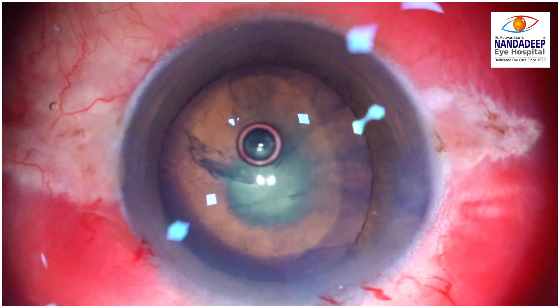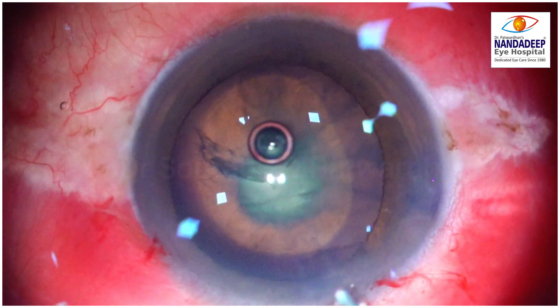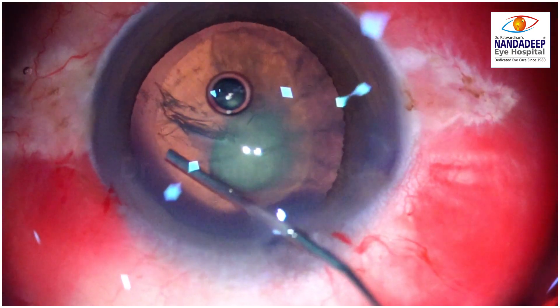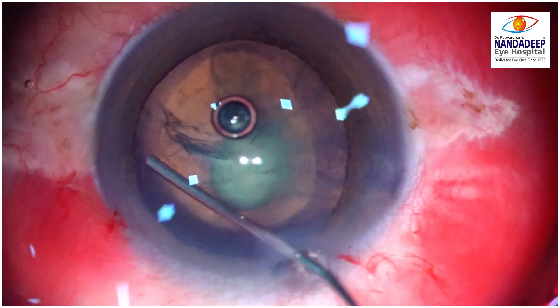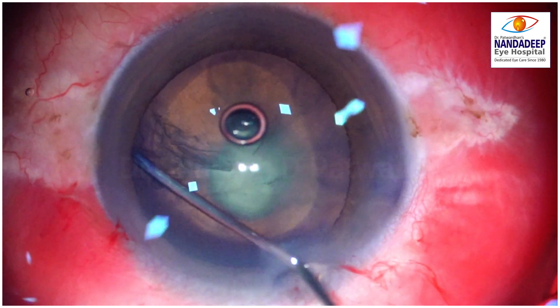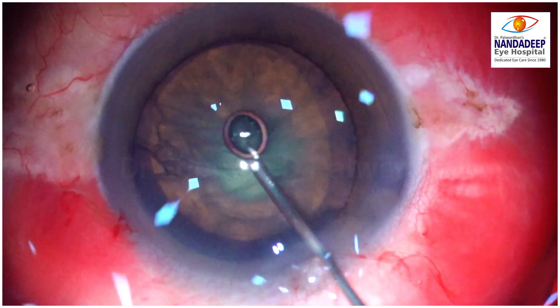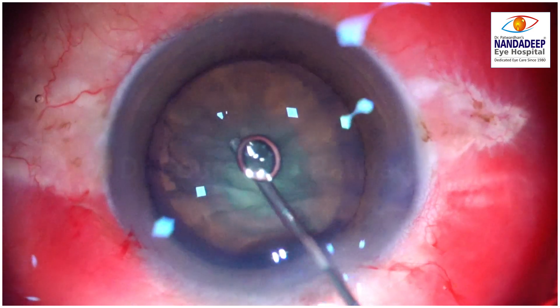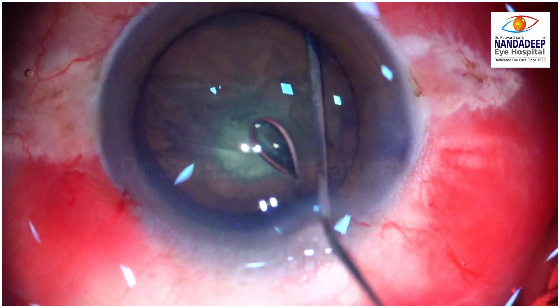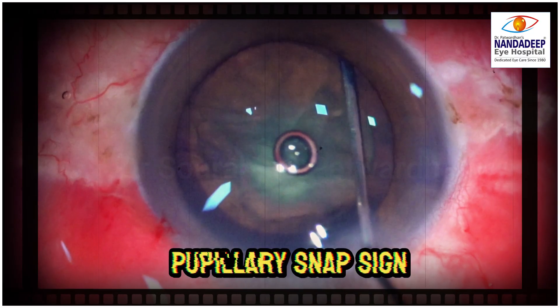The first wave, as you will see here, now passes nicely to the other side of the equator. There the injection goes — the fluid passes between the posterior capsule and the nucleus, and you can see the nice wave. The surgeon fails to tap the nucleus properly and then pushes more fluid.